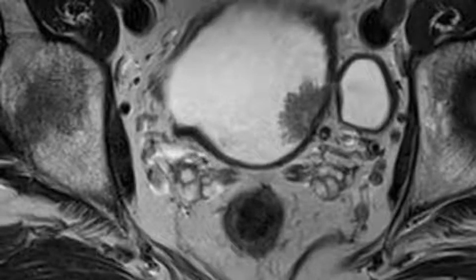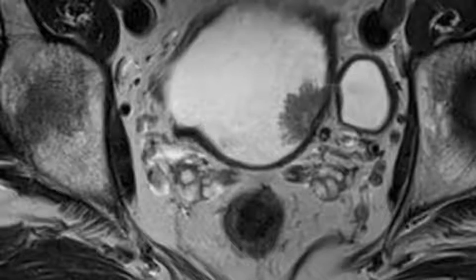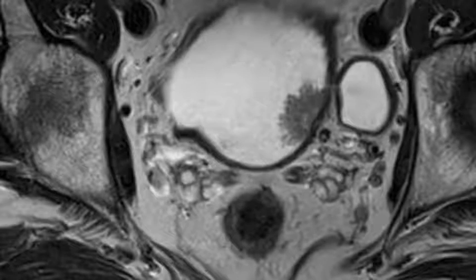Initial results in the evaluation of diffusion weighted images demonstrated reduced ADC in bladder cancer compared with the normal bladder wall. There is substantial inter-observer variation in ADC values obtained in a region of interest in the relatively thin bladder wall. Therefore, changes in signal intensity seen on diffusion-weighted images are more useful than information from ADC measurements.